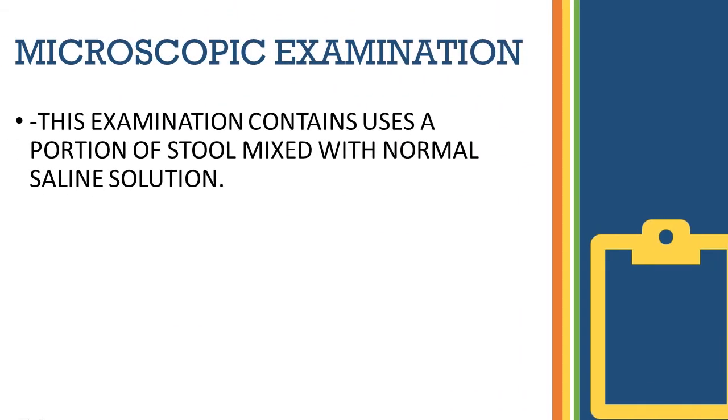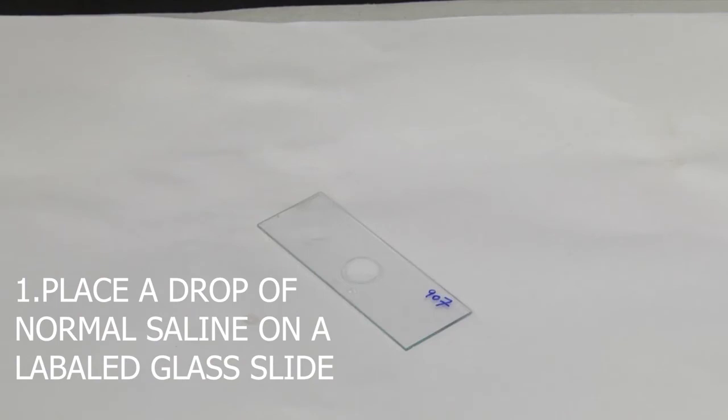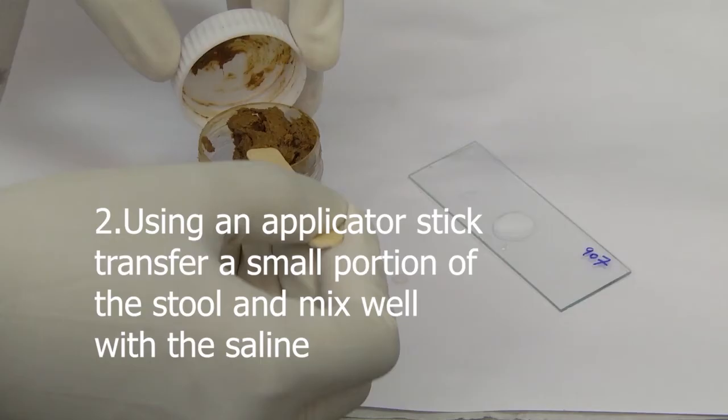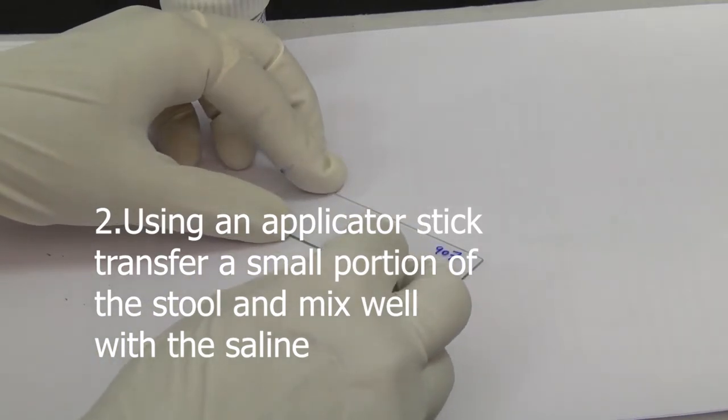Microscopic examination. This examination uses a portion of stool mixed with normal saline solution. Place a drop of normal saline on a labeled glass slide. Using an applicator stick, transfer a small portion of the stool and mix well with the saline.